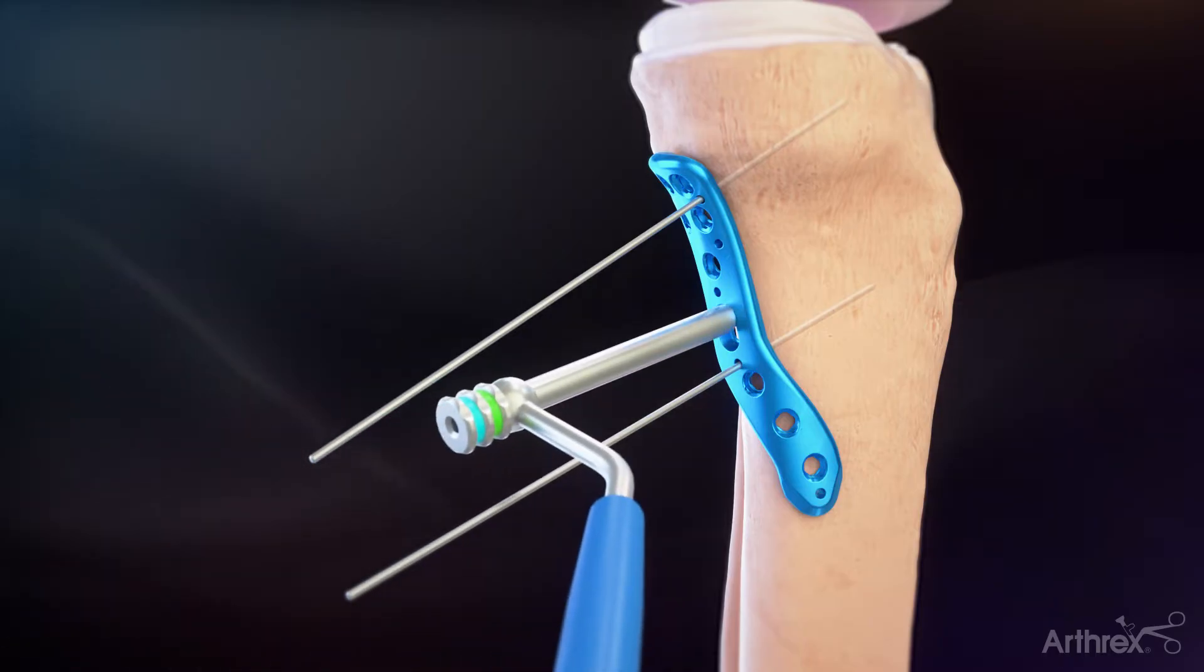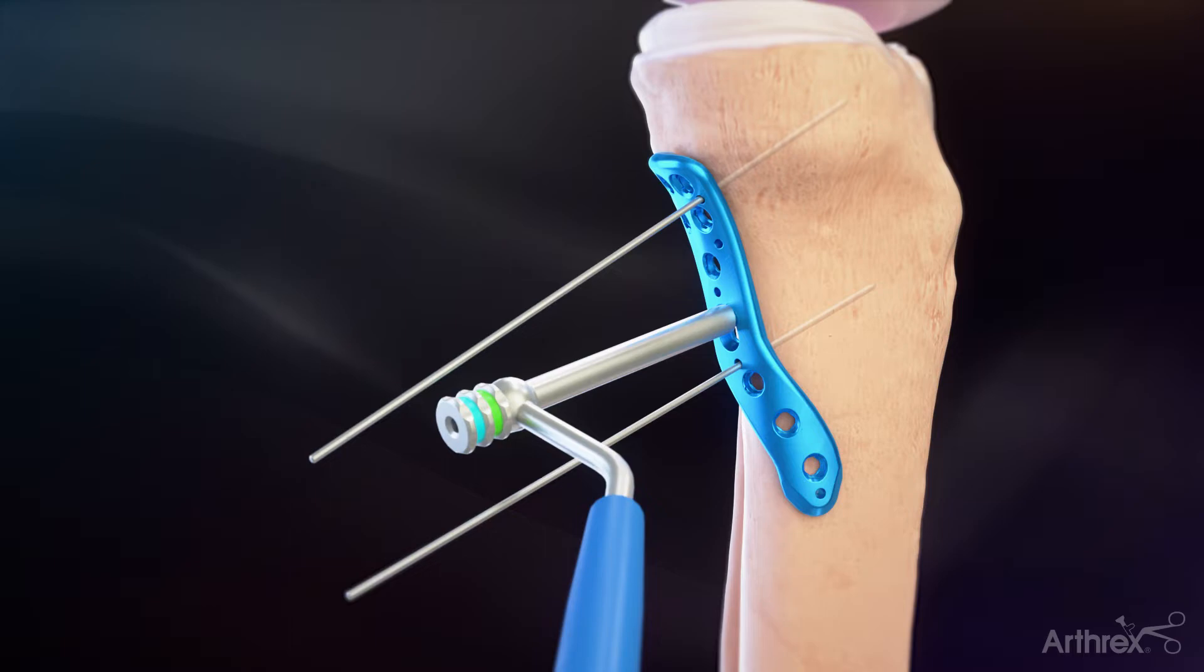The variable angle drill guide is comprised of the 2.8 mm drill guide threaded into the screw sheath and is used for 3.5 mm cortical or 3.5 mm variable angle locking screws.